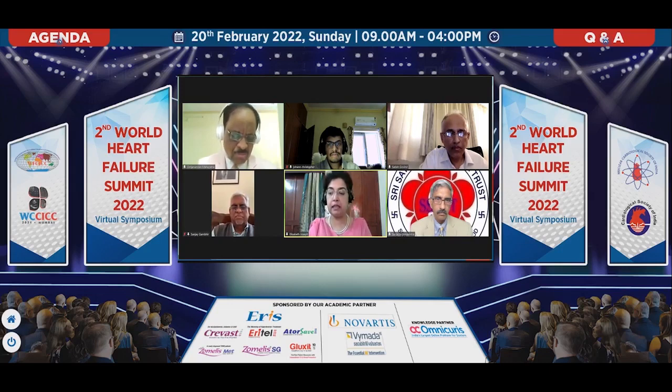Whereas it is in the cardiomyopathy where it helps us. And a classic example would be amyloid and Anderson-Fabry disease. Now, in amyloid, the T1 and ECV is grossly elevated. It's not that you can't diagnose amyloid without mapping, but you may be caught in situations where you're not really sure, and it gives you that additional tool. In Anderson-Fabry, the T1 is really low, but the ECV is maintained.